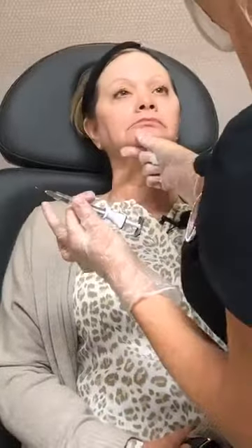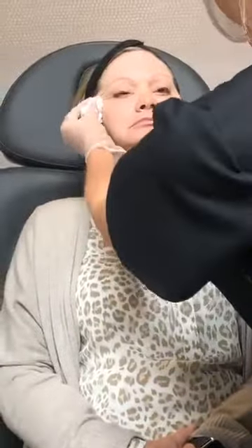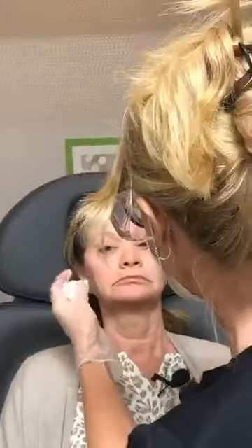She still doesn't have the final results on what it's going to look like as far as her skin tightening. So it's a deep microneedling with radio frequency, and the radio frequency is heat energy that stimulates collagen. And Linda has a heart shaped face anyway, which is great because some people who are more round, we want to create that heart shape. I think that's lifting beautifully. You can see a difference underneath there.